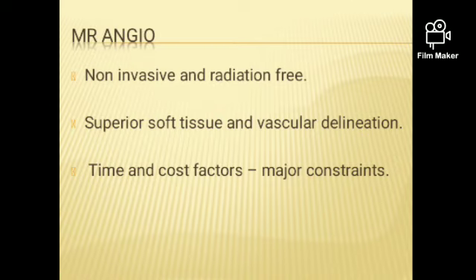In MRI, just remember, if you want to see the severity, how much the uptake is, then only we give the contrast, mainly in the pituitary glands or in post-operative studies of the breast. Otherwise there is no need for contrast. With the help of MRA and MRV, flow-based phenomena can also be seen without contrast. So with no contrast, small stenoses can be seen, as well as no radiation dose. That's why MRI is one of the great methods.